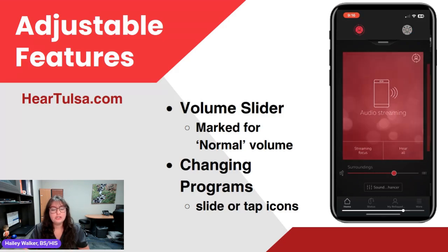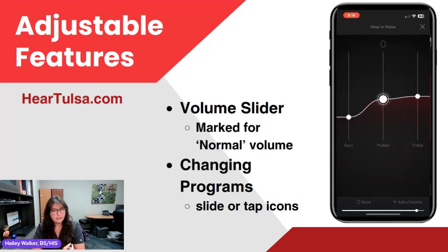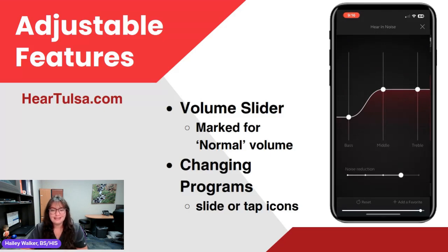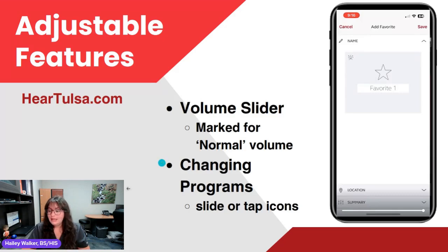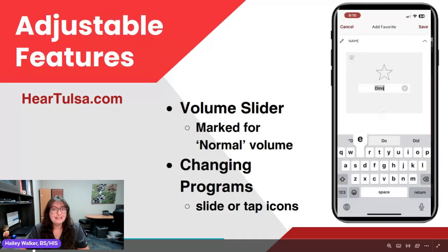I changed programs — I went over into hear in noise by sliding on the page. We can also tap the icons on the top to change programs. Now in hear in noise, I'm going to make a custom program. I'm going in and changing my settings exactly how I want, and then I'm going to label this new program 'dinner group.' I've set it up using the hearing in noise program to give me that benefit from that program.